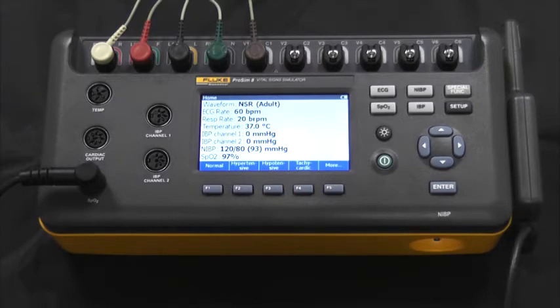The ProSim 8 is intended to be used to test and verify the basic operation of patient monitoring devices or systems used to monitor various physiological parameters of a patient. The ProSim 8 can also be used to calibrate in some cases and can also be used for training purposes.